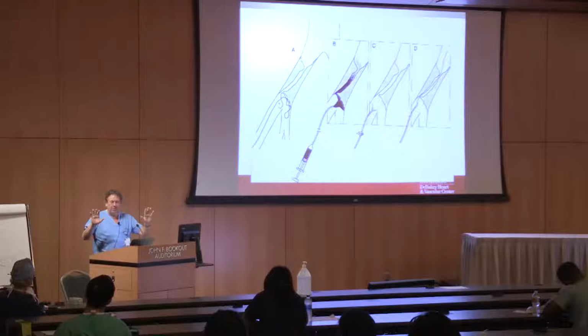So you'll see the reps when you're doing endografts, for example, they're often drawing in the bones in the background. So it's a visual cue that something has moved, okay? And this is one of the ways you can get in trouble. You perfectly measure everything, you've got everything lined up, and all of a sudden, you look away to do something, and somebody moves the image intensifier or floats the table, and now you think that the marks on the screen are where you're going to mark it, and it's completely off.